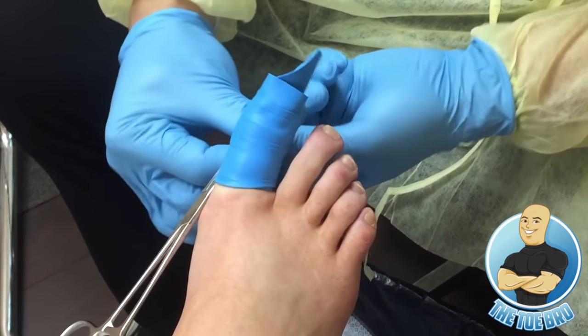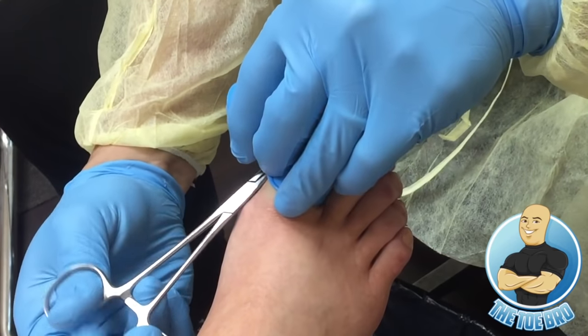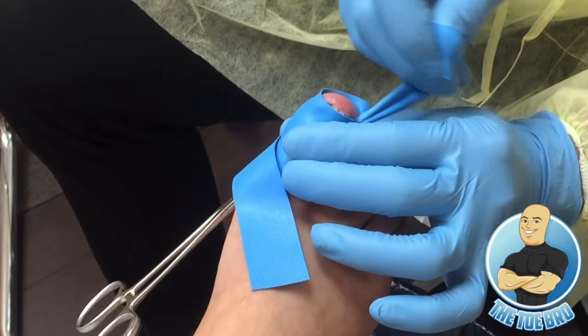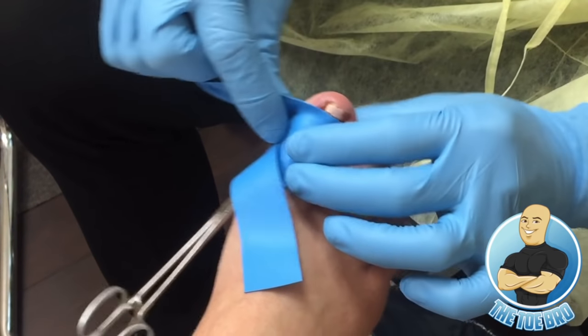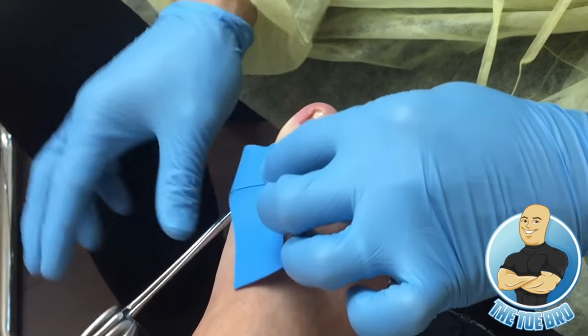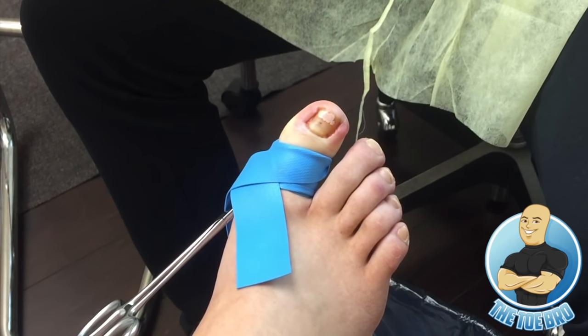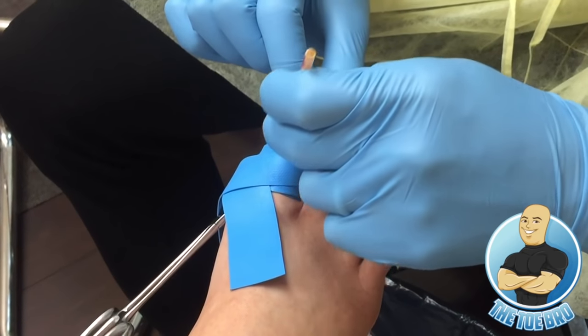The next thing is we need a bloodless field. We are going to be applying an acid once we remove the ingrown toenail to kill the nail matrix. This would stop the nail from ever growing back. If there's too much blood in the area, it will actually dilute the acid and we might not have the reaction that we want. We want it to be very bloodless so the acid does not get diluted.